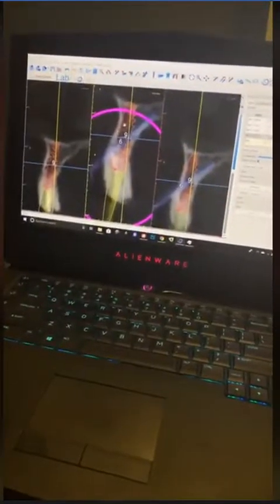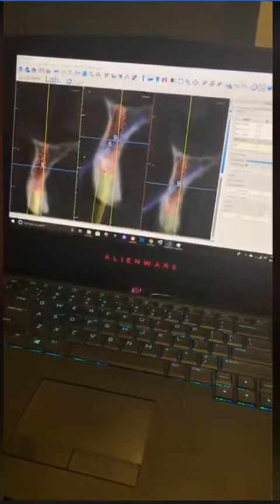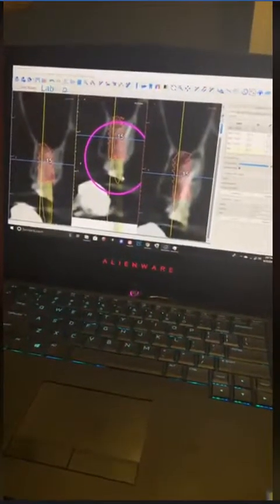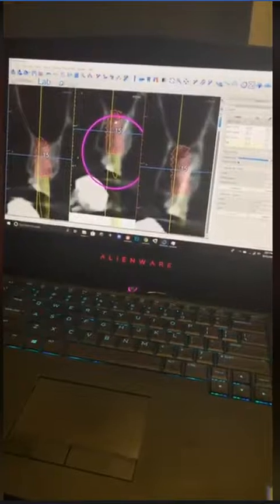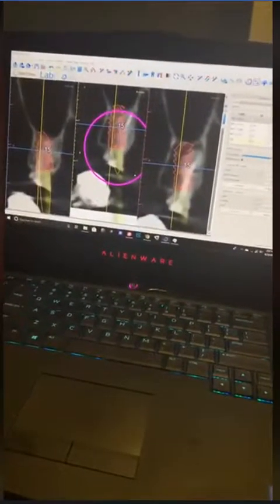Number 9, same story. Okay, 375 by 13 millimeter long, and number 15 is 5 by 10. Okay, and I'm engaging the floor of the sinus, slightly peeked into the sinus maybe in some of the areas, but I really don't care.